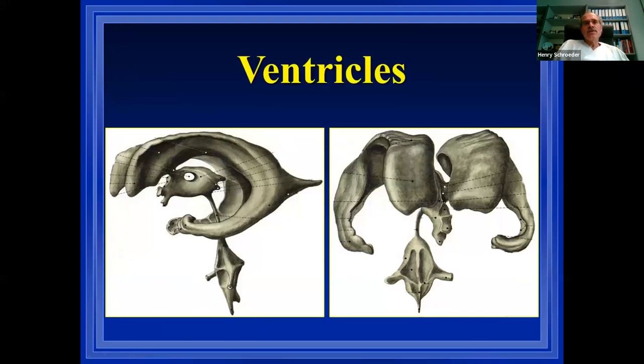When we talk about intraventricular endoscopy, we are dealing with the ventricular system. We have the lateral ventricle, the foramen of Monro leading to the third ventricle, then the aqueduct, and the fourth ventricle. If you have an obstruction anywhere here, you have a dilation of the part above it, and then it is ideal to approach it with an endoscope. But also in normal-sized ventricles, if you have the right ventriculoscope, you can take a biopsy or perform other procedures.